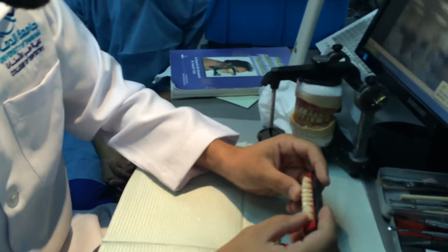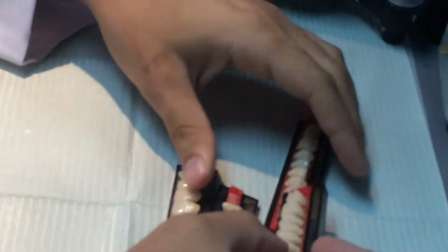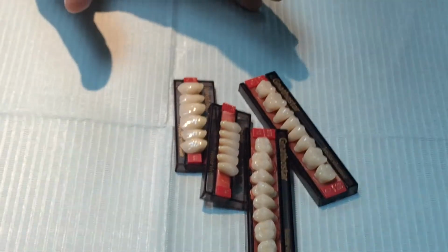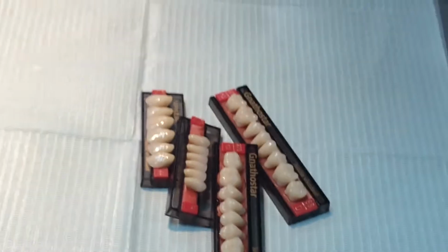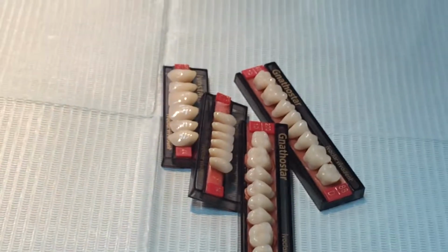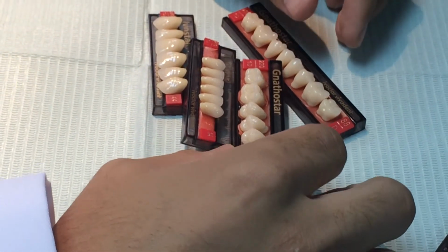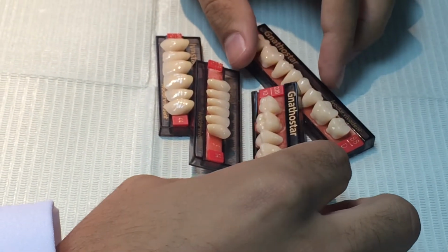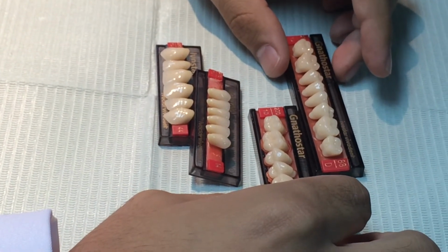Guys, today we're going to start setting of the teeth, and we're going to distribute a teeth set to each of you, like what we have here. Each of you has this teeth set, and we have to know where is the anterior and posterior, where is the upper and lower, and where is the position for each tooth. Okay.